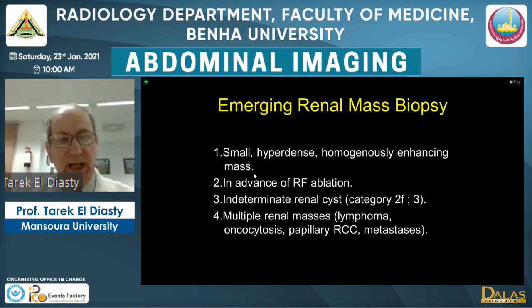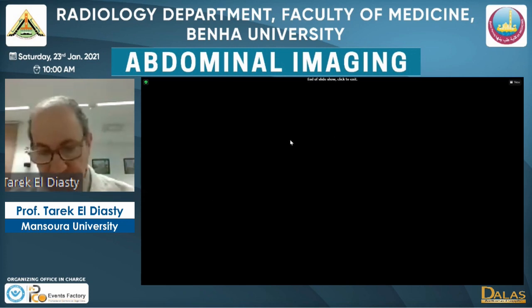And now in advance of radiofrequency ablation, it is recommended to do a biopsy. And the last one is the small, less than 3 centimeter, hyperdense on CT and homogeneously enhancing mass, because about 25% of these masses prove to be benign lesions. So these are the emerging indications. And thank you very much for your attention.